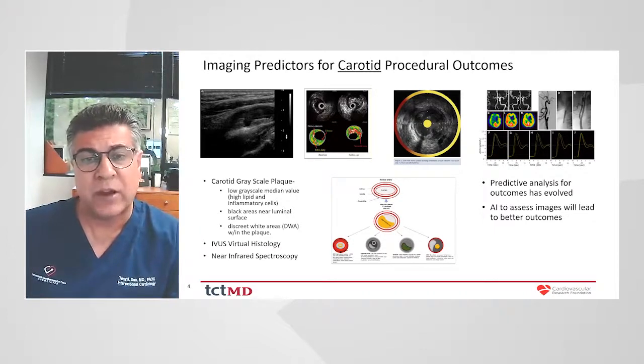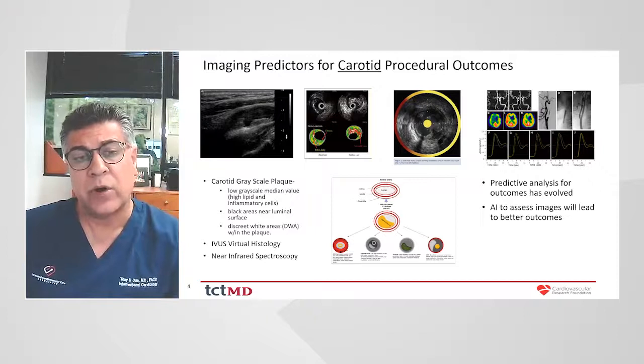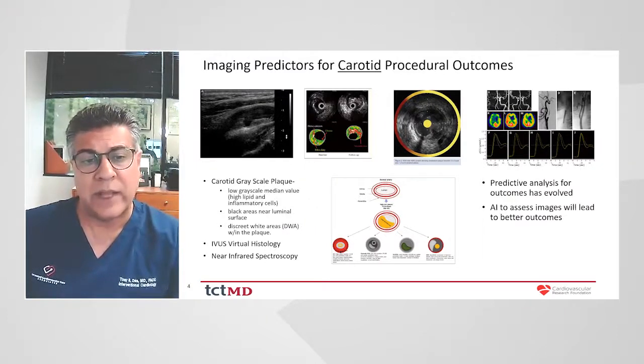It's never really taken off as an identifiable tool that we would use to predict, but I think that as these predictive analyses start to use AI and machine learning, those predictive analyses, particularly in spaces where the outcomes could be quite detrimental, like a carotid leading to a stroke or a lower extremity intervention leading to distal embolization, this aggregating of the data in an AI-based technology like we have here may actually turn out to be very useful for us as we do vascular interventions.